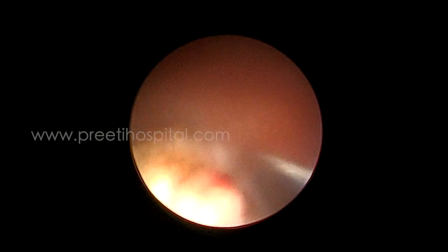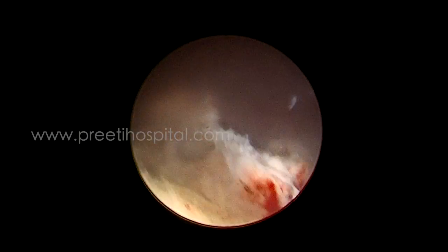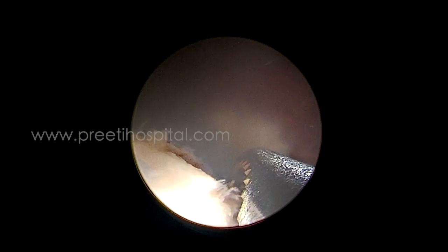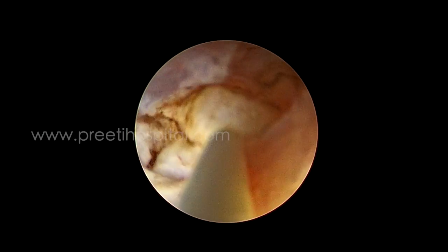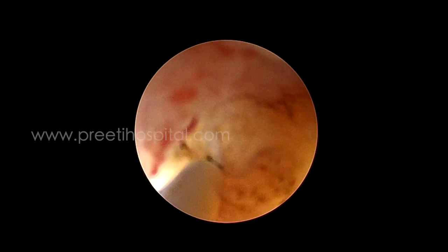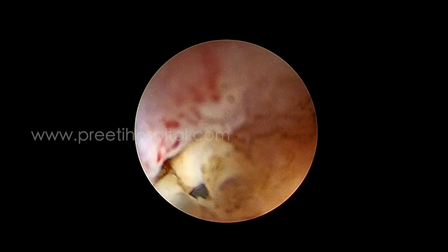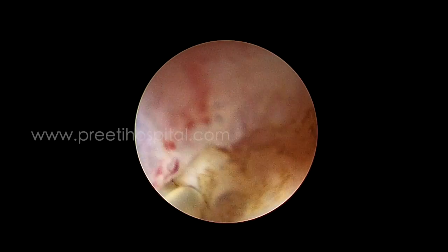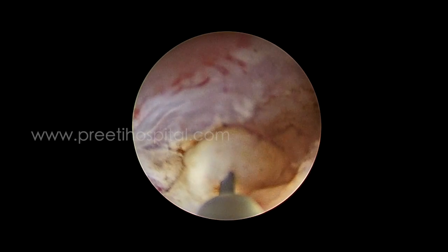After identifying the injury, we completed the enucleation. We decided to place a ureteric catheter because the bleeding was not much, and wanted to pass a guide wire. However, I could not pass any guide wire or ureteric catheter because it was a little retracted. The orifice was identified every time peristalsis occurred, but a mucosal flap prevented even the smallest guide wire from entering the ureter. After 2-3 attempts, we abandoned the attempt.